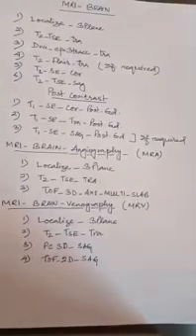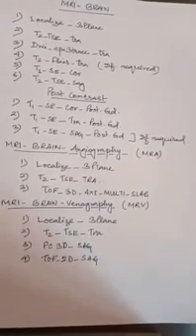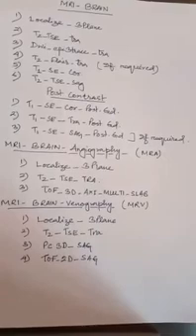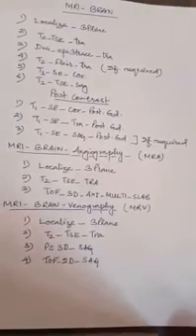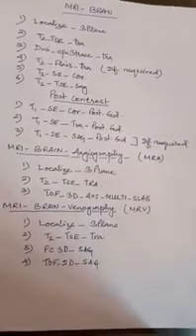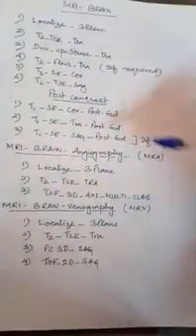Today I am going to discuss MRI brain. What are the sequences we are using? The basic sequences we need to apply for MRI brain. If the brain parenchyma is normal, for a normal brain these are the sequences we are using.